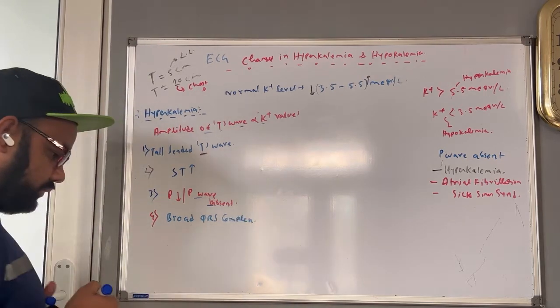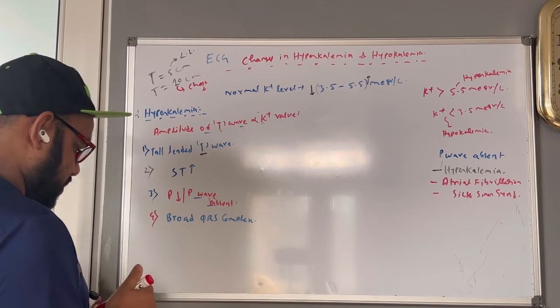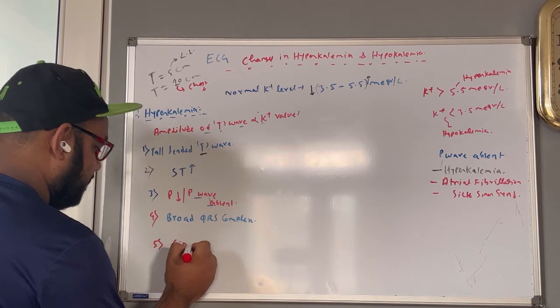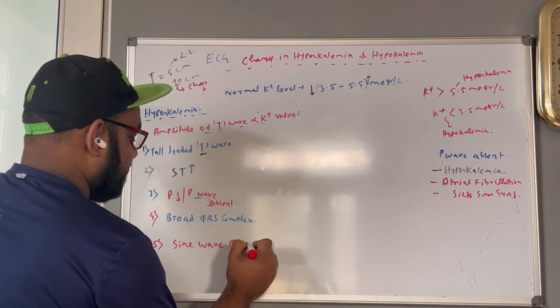Apart from that, another thing we get is the sine wave pattern. Now what is the sine wave pattern?